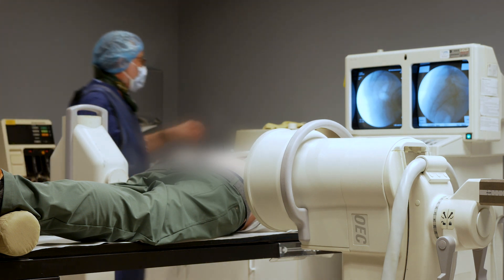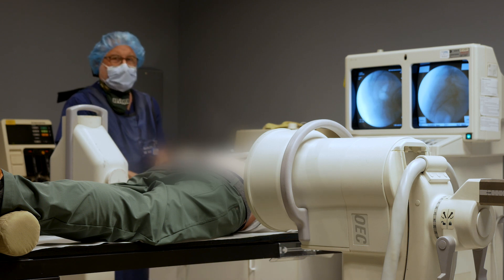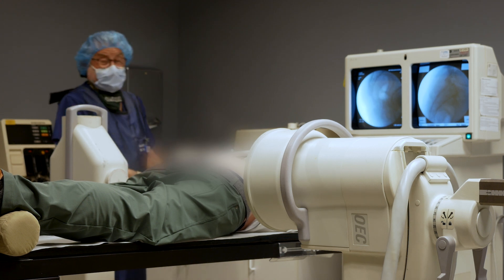Today we're doing what's called a ganglion impar block, where we're putting some local anesthetic and steroids right in front of his coccyx to try to settle down his coccyx pain. He was just telling me he's a commercial airline pilot.